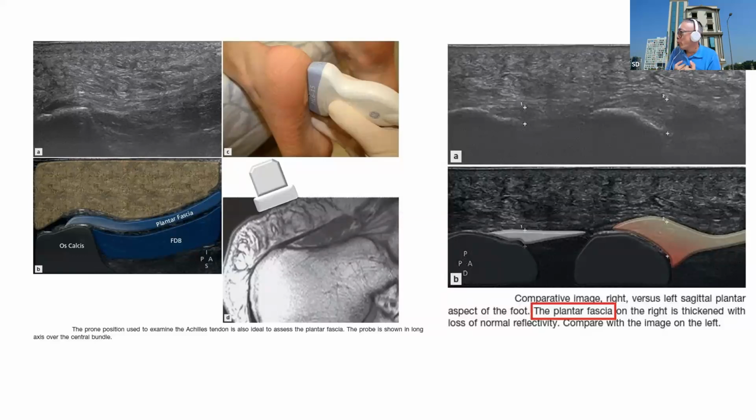Right now, I'm at home, I don't have the plastic with me. But in the next class, I promise to show you all how to use a sterile glove as a probe cover. It is cheap and best, and I think you all will love it. That is my responsibility. I'll show you.